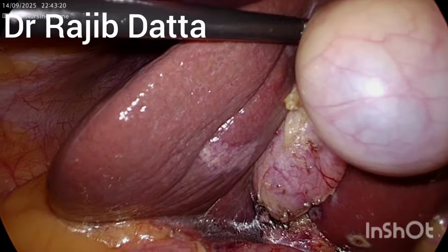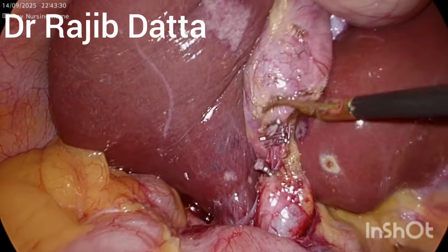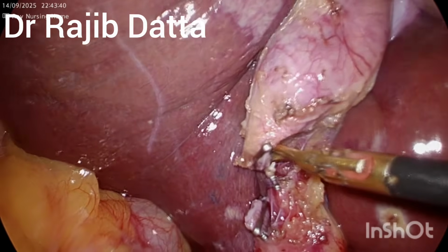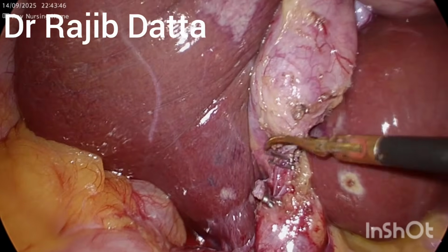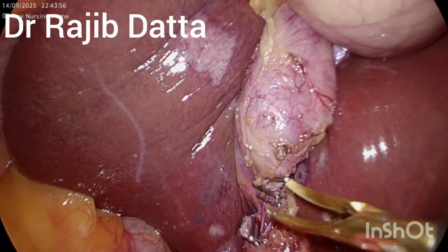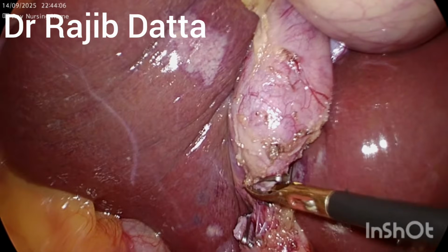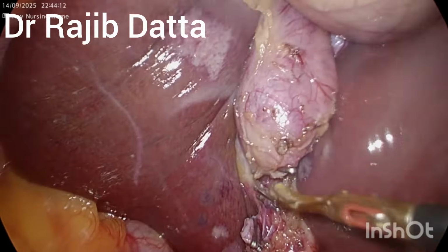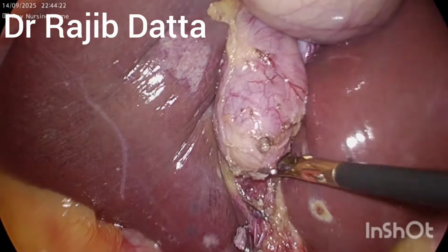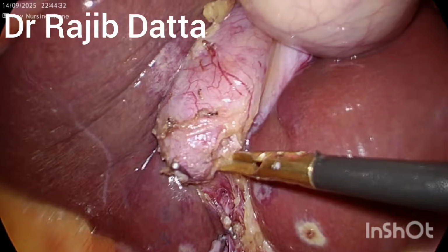The bipolar shearer has to be introduced for proper separation and coagulation of the cystic artery. During this bipolar shearer application, special precautions have been taken not to dissipate the heat towards the Liga clip. So for this purpose the traction and counter traction is going on. I am just trying to properly delineate the plane.